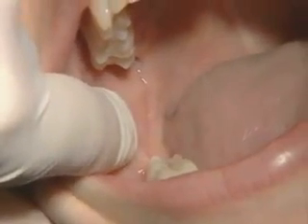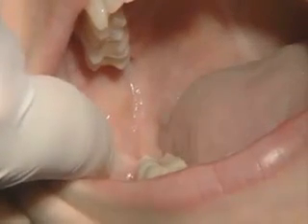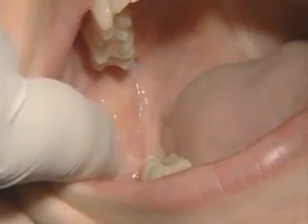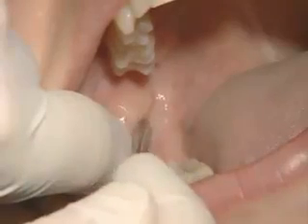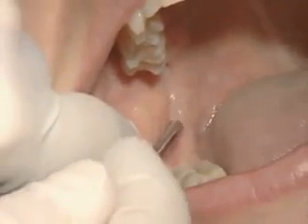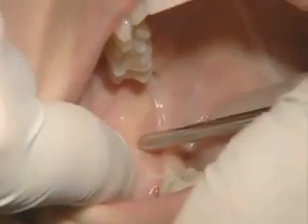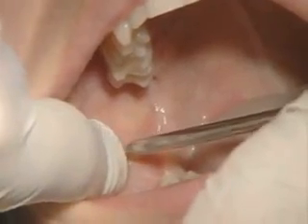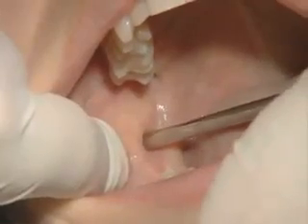The internal oblique ridge marks an important landmark because it is just medial to this point where the needle will be inserted. By retracting your finger out laterally again and resting on the external oblique ridge, you expose the pterygo-temporal depression, shown at the end of the probe here. It is within this depression that the needle will be inserted. The medial border of the depression is the pterygo-mandibular rafae, and the needle insertion will be within that depression, lateral to the rafae. The height of insertion will be roughly the midpoint of your fingernail, anywhere from the midpoint to the height of your fingernail.